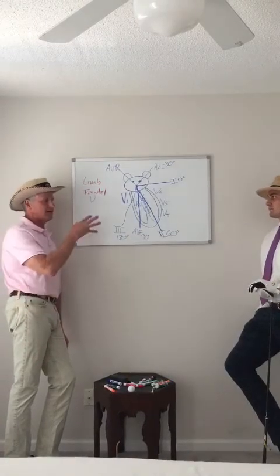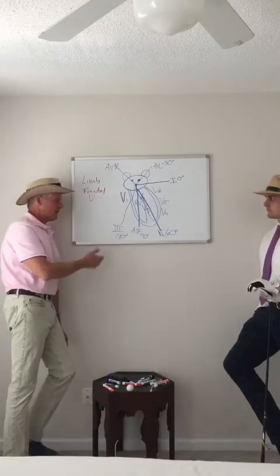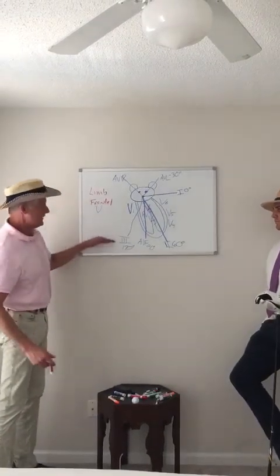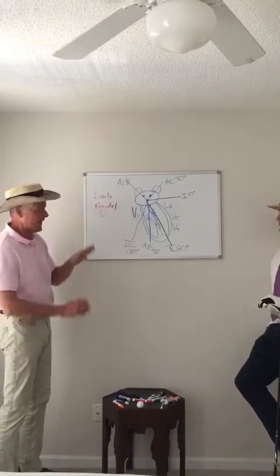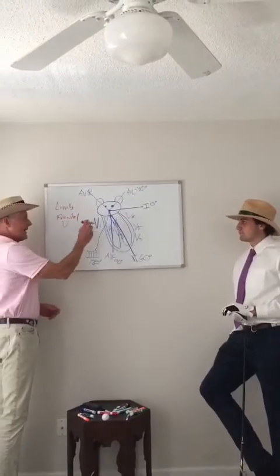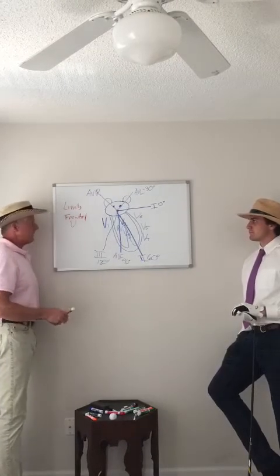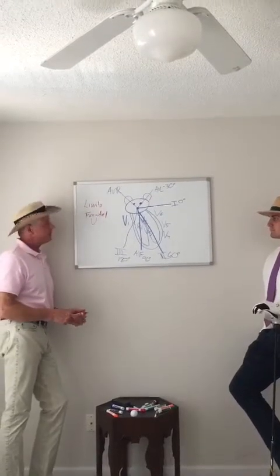So the utility of the rat is to locate the leads around the heart without memorizing that 2, 3, and AVF look at the inferior wall of the heart. If you see this rat in your mind, you know that. You don't have to ever remember that. And we added in the V leads because that's half the EKG, right? Absolutely. So knowing that and adding the prefix antero has enormous utility, but we're going to have to keep moving from here, and we'll talk about those things later.